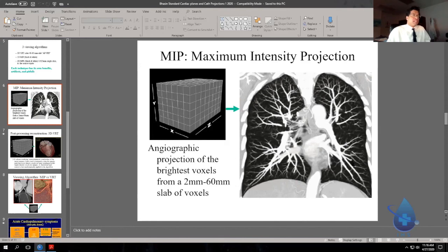So if you think about it, that is inherently an angiographic projection. When you're in the cath lab and you inject contrast, the image intensifier, the II, is only bringing forward to the TV screen the brightest. It's only bringing the contrast forward, and it's burying everything else. This week in this course, we're going to tell each other the truth, okay? And one of the truths amongst cardiologists that we fail to tell is that fluoroscopy is blind, okay?